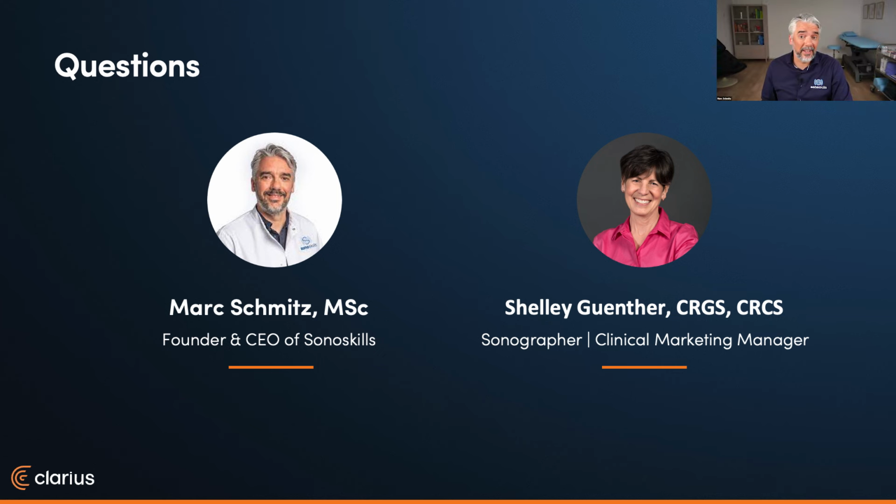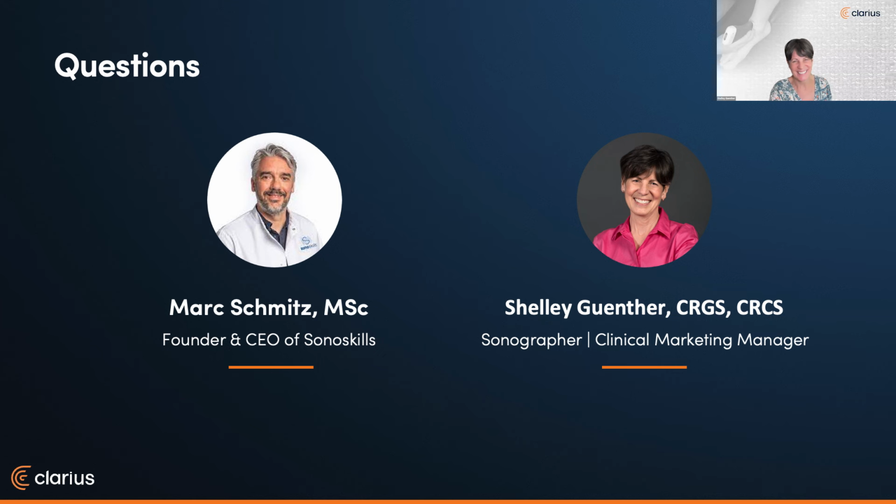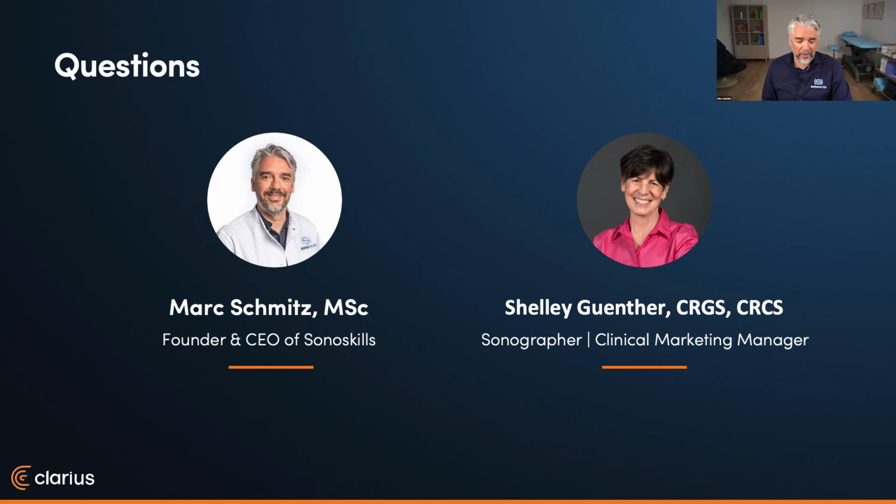I have to say that the AI tool is really cool. Also, the automated measurement is really fantastic. I think that is a really good addition to your flow of working, and it gives you so much extra information. So that is really well done.